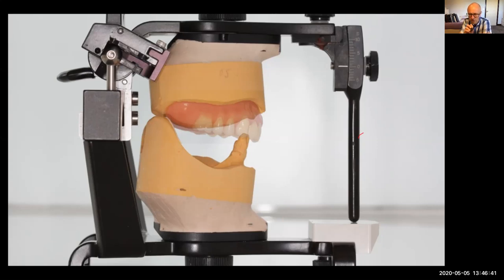So imagine if Anne was going to have a fixed upper bridge on implants there, there'd be no room to put our implants or our metalwork at the back to give us enough strength to make a denture. This is really, really important. And also, imagine if she had a locator attachment, just one single locator at the back there, there'd still be an issue with space. We would have to drop the whole of the occlusal plane and make the patient look more toothy. And this is what we often see.